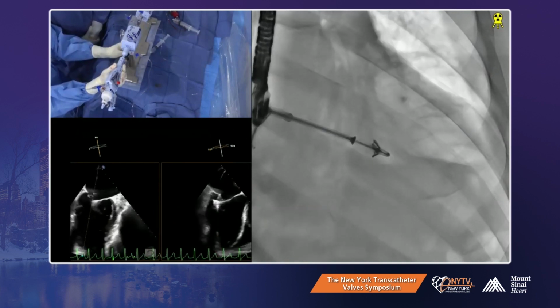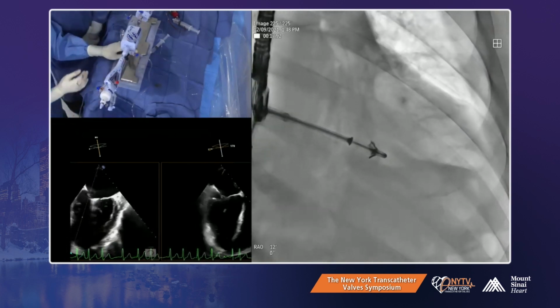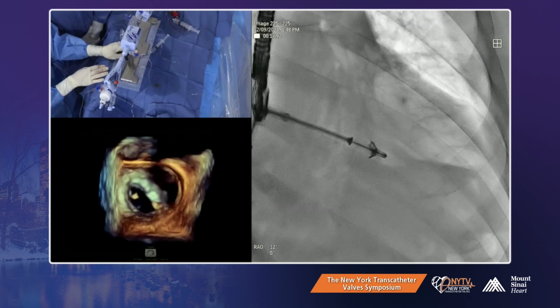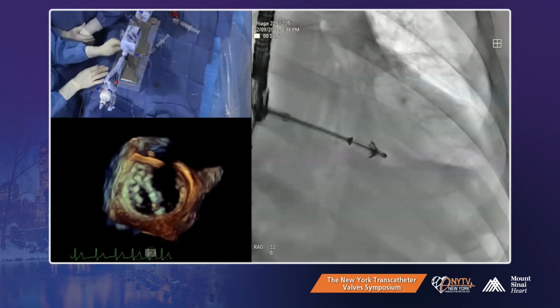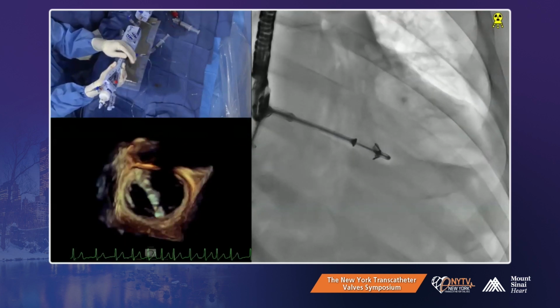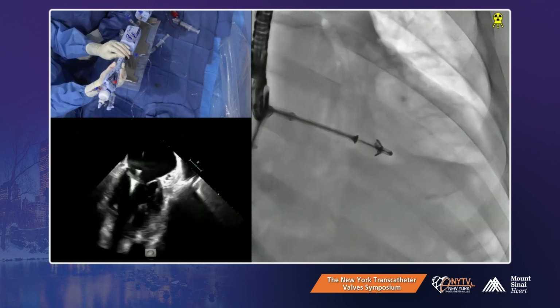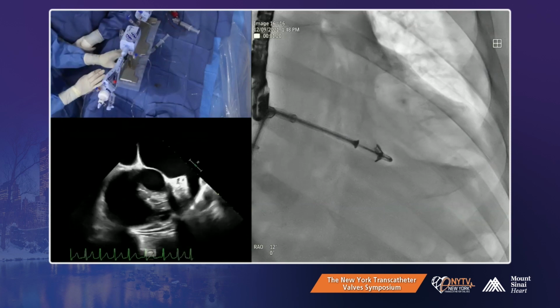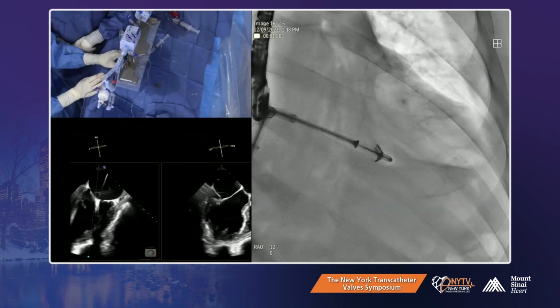Yeah, I think our orientation has changed. Our orientation has not changed out there. Yeah, I mean, it's the same. Aorta is at the top. And we can go back into the atrium and reset, but we can do that too if we want to.